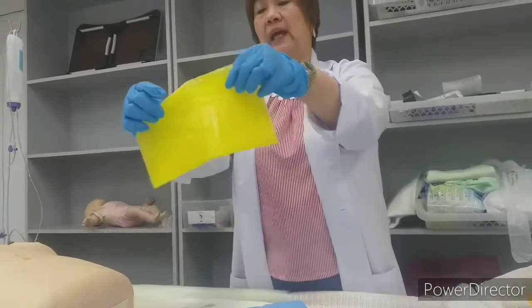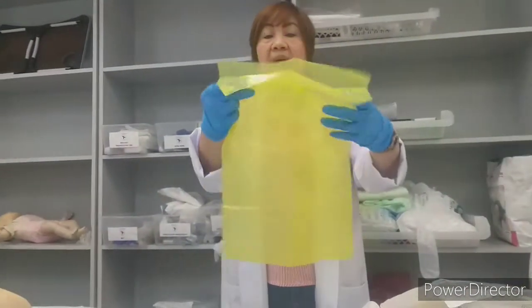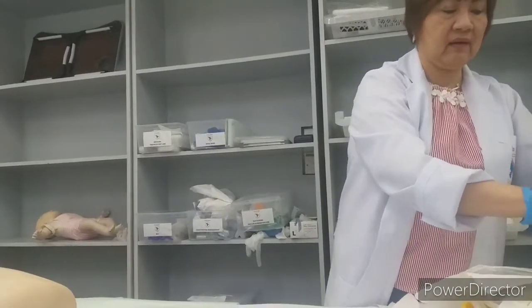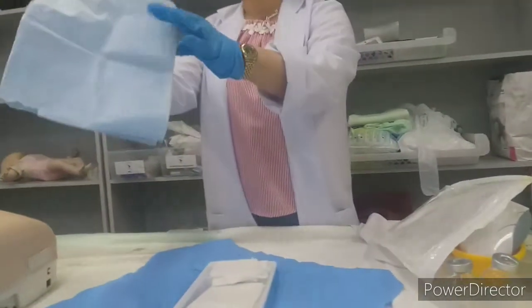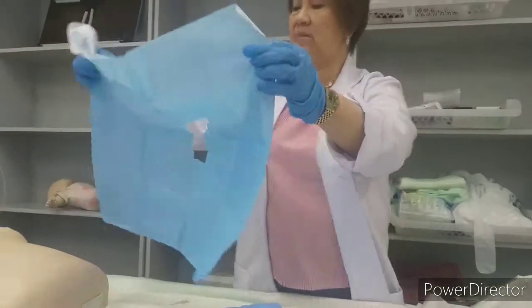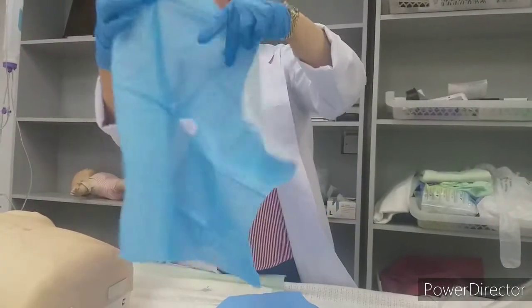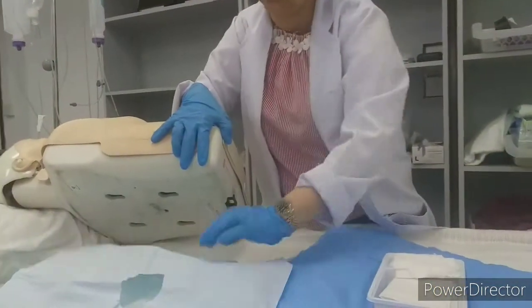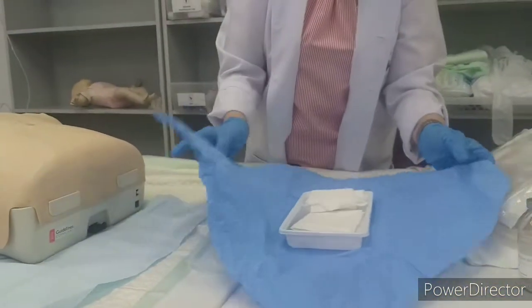Take out the yellow waste bag. There is adhesive here. You can just stick it on the side of the rail, okay, like that, or keep it on the side. Now, take this out. This is a disposable dressing pan. So the underneath is plastic and here is the absorbent one. So let the patient, I will just put my pad under it. Okay, so the pad is already there in place.